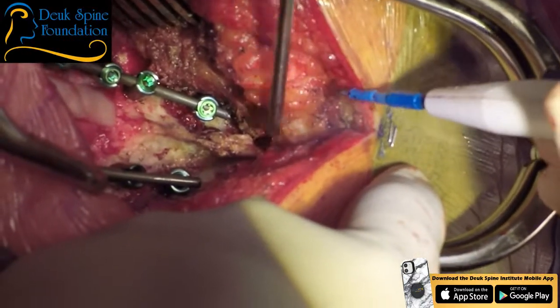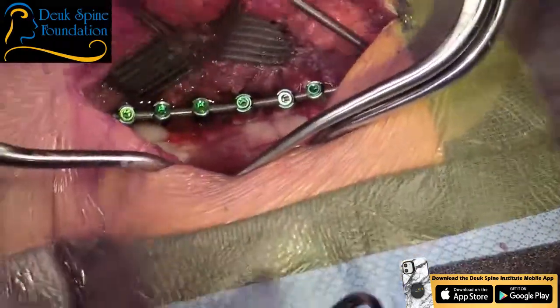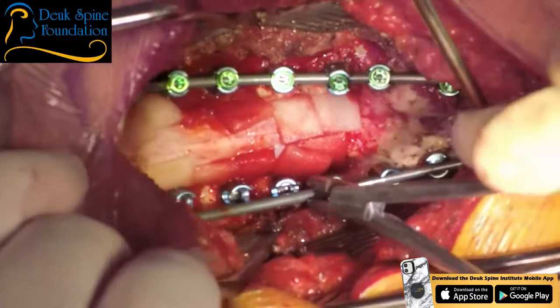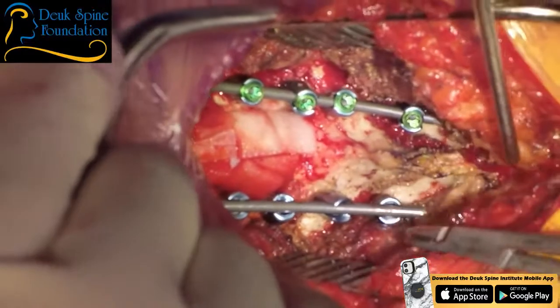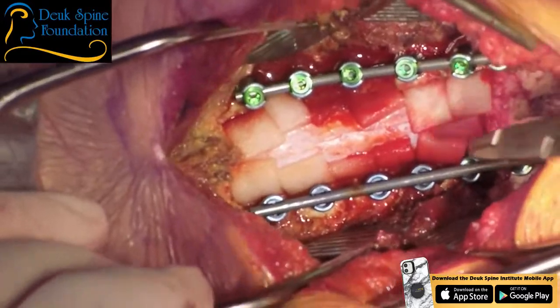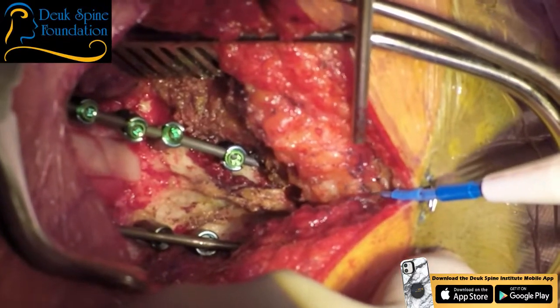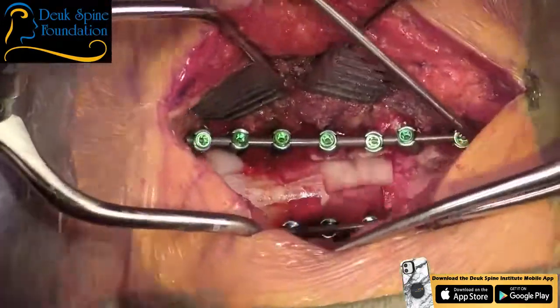The key is you don't ever want to touch your Bovie on coagulate onto the skin. You'll get an area of the wound that will never heal. Are we okay? Still going? Let me just look at this real quick. I need a little bit more there. All right, where is it bleeding? Bovie? You see it somewhere? No? Good? Bender? Yes, good or no?